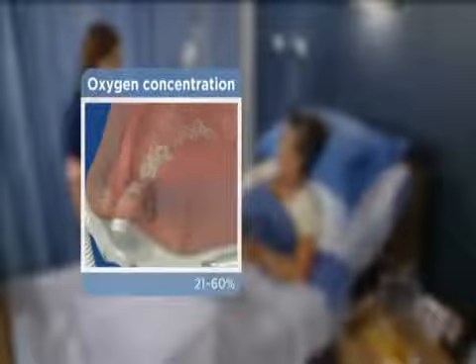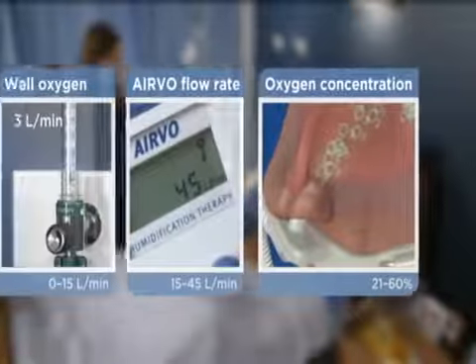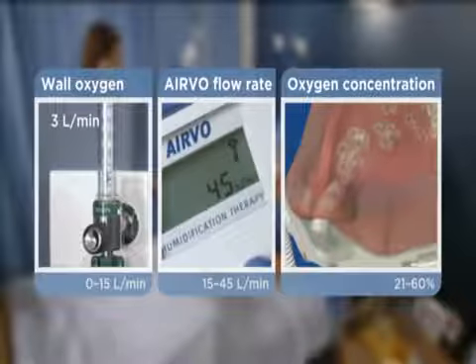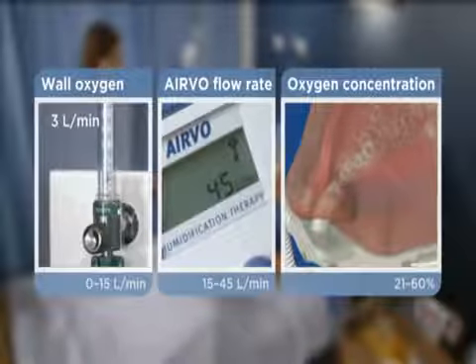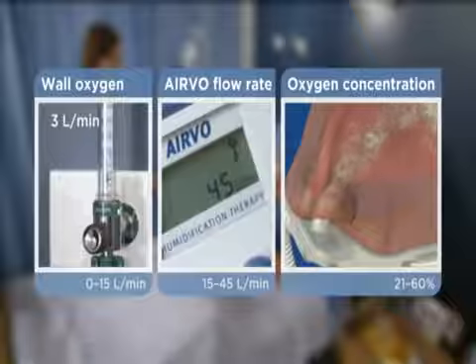The oxygen concentration in the gas delivered by the Airvo depends on two values: the Airvo flow rate and the flow rate of oxygen from your wall supply. The total flow rate delivered to the patient, however, is controlled by the Airvo. Adding oxygen doesn't change the flow rate of the respiratory gas supplied.